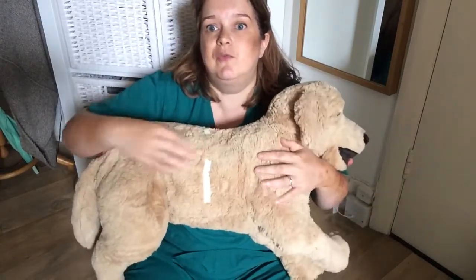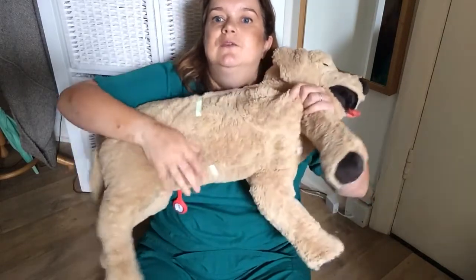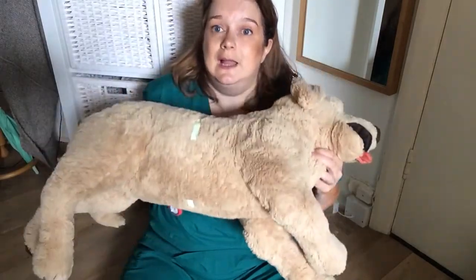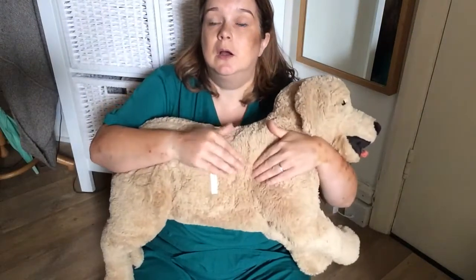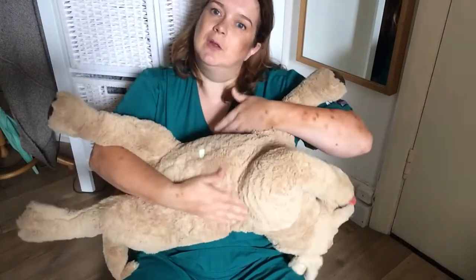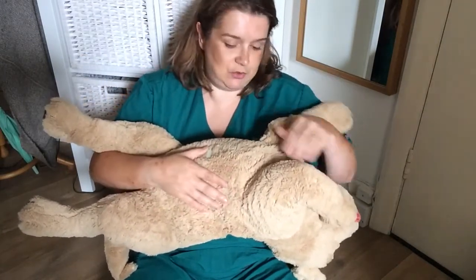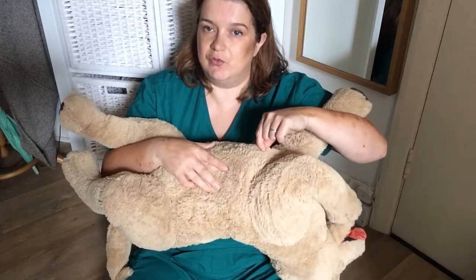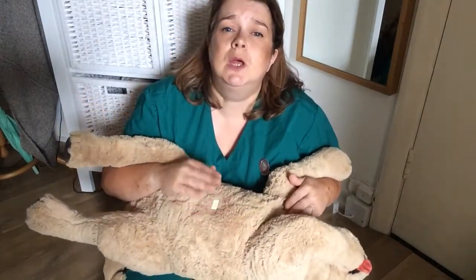So there are a few simple steps: we've got the last rib, we've got the thoracolumbar junction, we've got the xiphisternum, and we've got the manubrium and thoracic inlet. Those are your landmarks. You're going to get your lateral from that by centering in the middle of the rib cage — on this dog it comes just with the shoulder. For a VD, you've got your cranial and caudal points, then the lateral skin surfaces, and you're going to center in the middle. Following that shoulder blade round would give you your centering point. I'm not going to put the centering points on because you'd end up with far too many things to focus on — the centering is often a soft tissue point so it's harder to find.